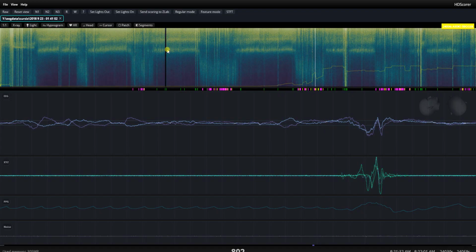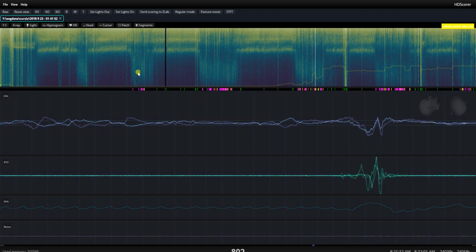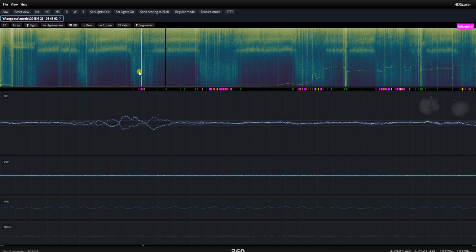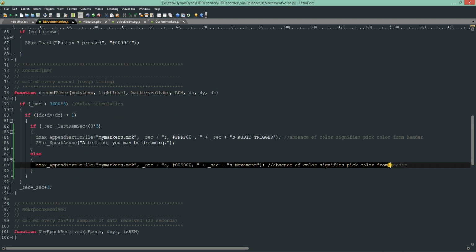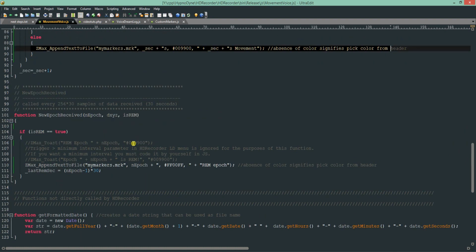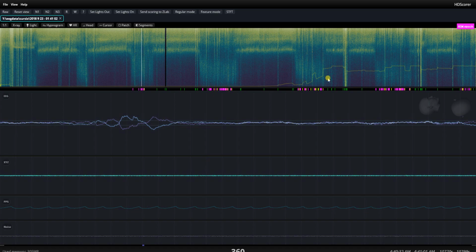This is the scoring software, HD Scorer, and this is a display that comes from a marker file. To import a marker file, just go to Import Markers. The marker file is just a text file. And so what we're seeing here, the colors in purple are the epochs in which REM was detected. And the way that's output, it's from here. No, sorry, where is that? Epochs. Okay, so here, whenever there's a REM epoch, it creates a purple marker. So we're seeing that in purple.